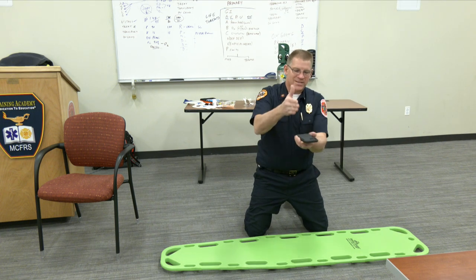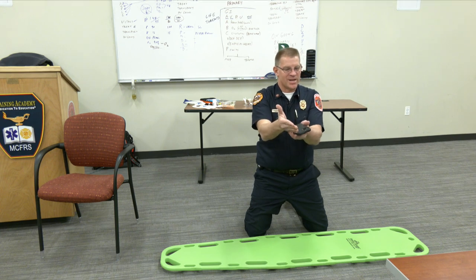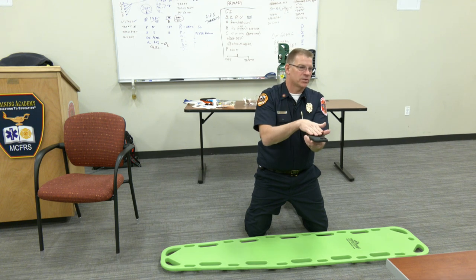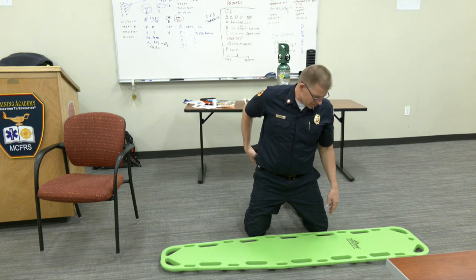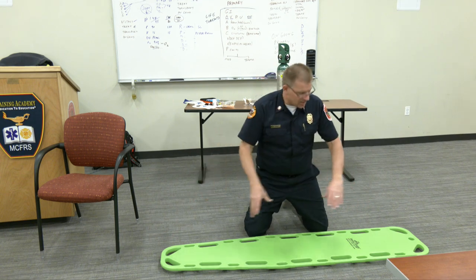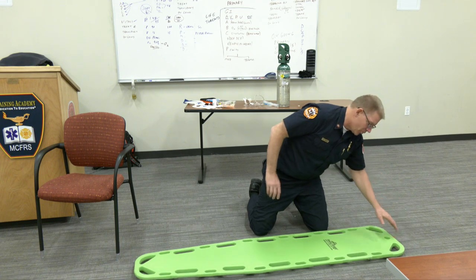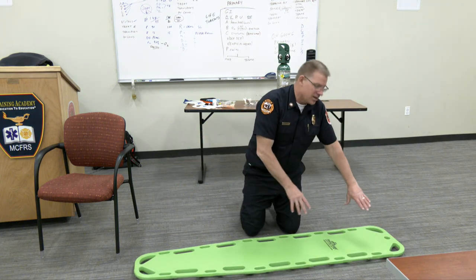Does that make sense? By rolling them a little extra and then raising the board up, we've just taken away the reason for rolling them extra. Why go the extra roll if you're going to raise the board up? Now you're just at 90 and you'll fall short. Any time we adjust people, we go down then up — don't go up first, because the seat collar can catch. We want to go down and in line, then up and in line.